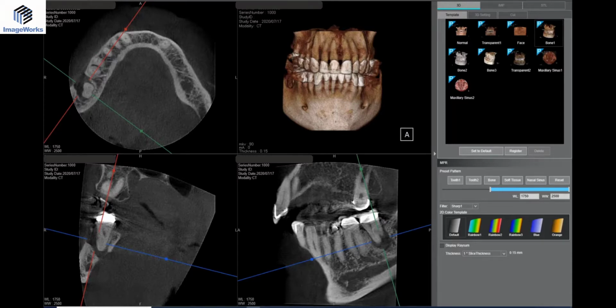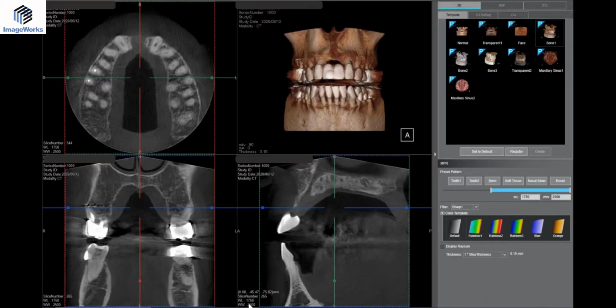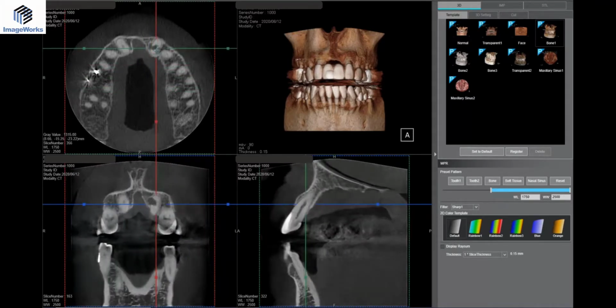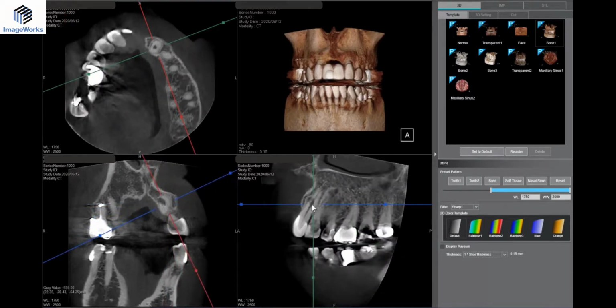Let me get another one here. Okay, this looks like tooth number 9, maybe 10. I can't recall offhand. He's missing 11, and 12 is in the 11 space and rotated or something. But off this picture, we've got some internal resorption going to an external site and starting to blow out. I just wanted a clearer picture of it, so I ordered up my cone beam. And there it is right there. You can see it blowing out there.